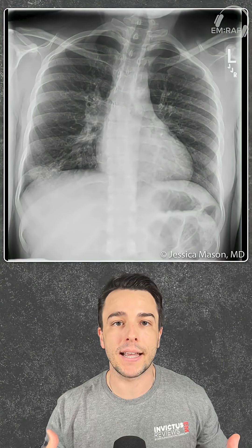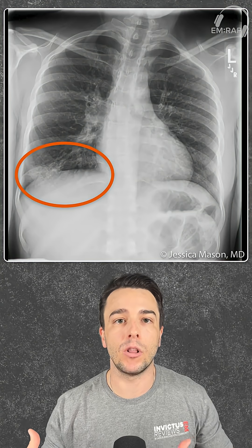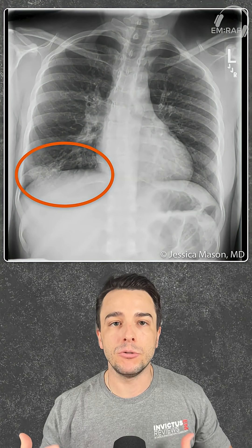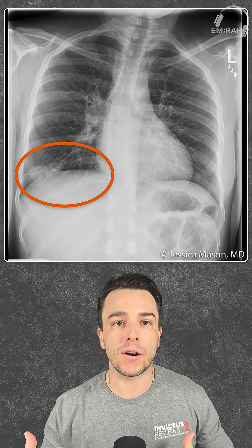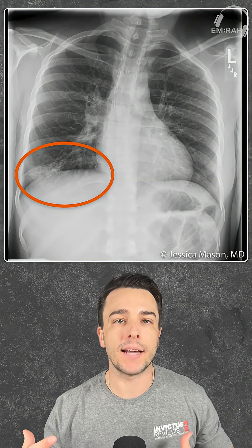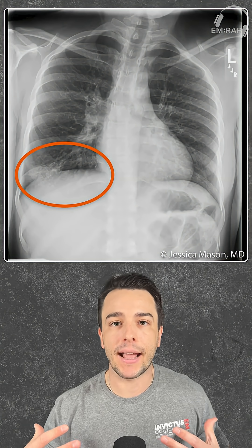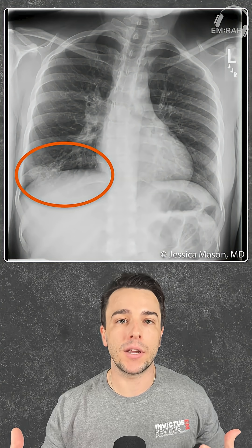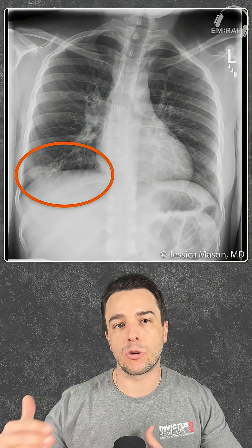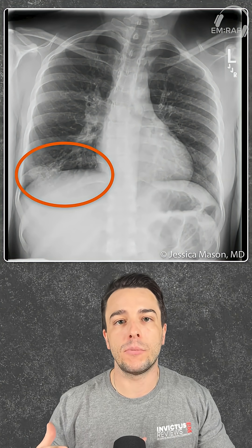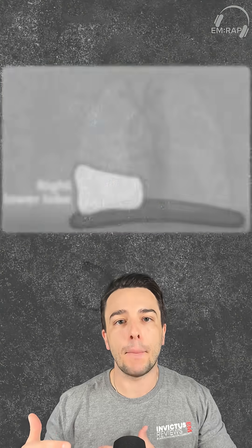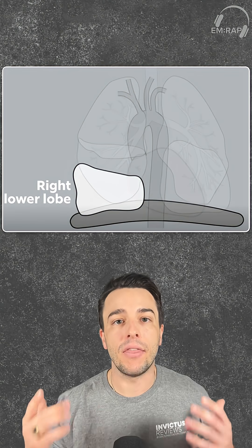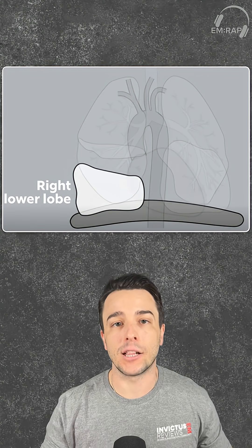In this example, we see a right lower lobe pneumonia. It's kind of subtle here, but you do see that blurring of that right diaphragm. We think of that blurring as pus from that pneumonia in that right lower lobe, because the right lower lobe of the lung abuts that right diaphragm border. And that is silhouette sign.